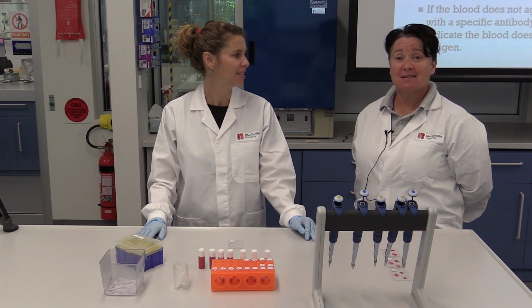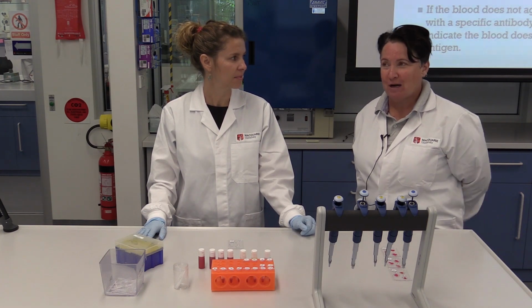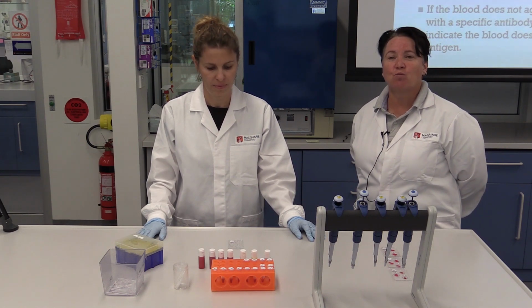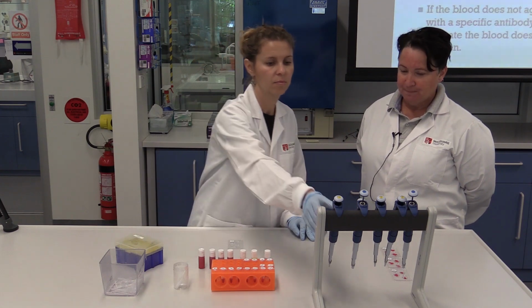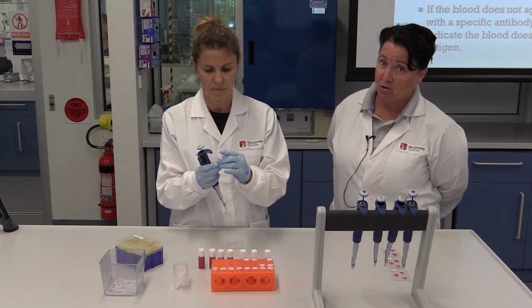Okay, so exercise 2, ABO blood typing, and we're still in prac 5. Fleur's going to demonstrate the procedure to actually determine what antigens human bloods carry. First, what we're setting up is the positive controls.